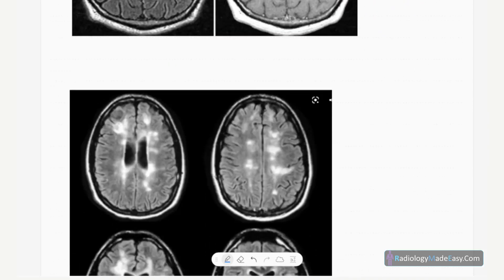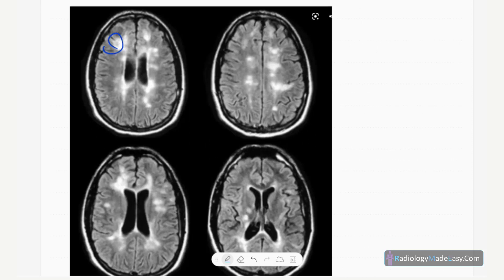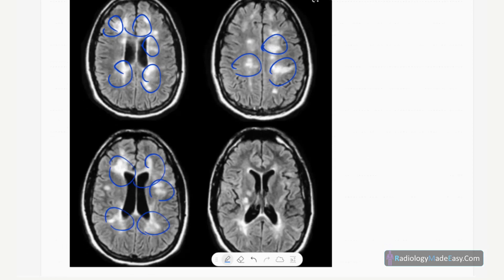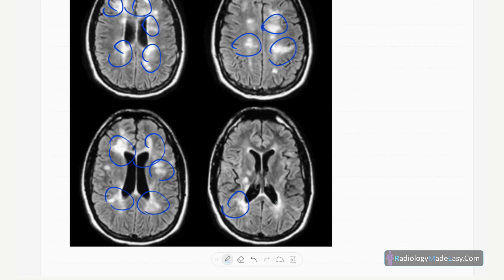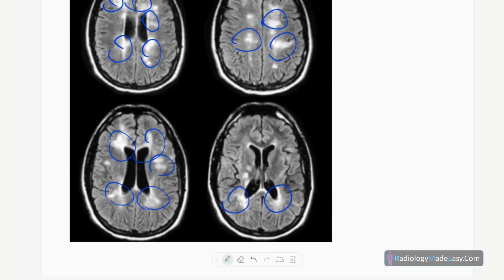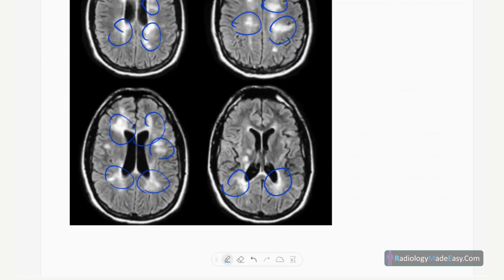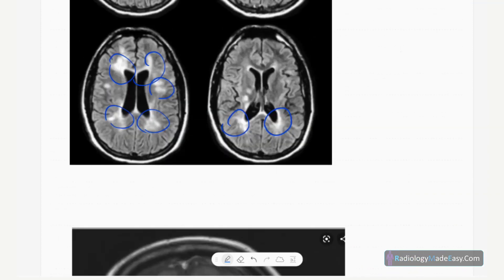This is another example showing extensive disease. You can see multiple periventricular white matter lesions forming confluent areas — multiple areas of involvement representing more advanced disease.